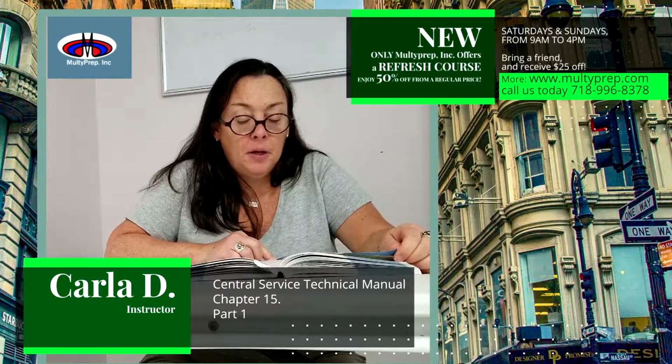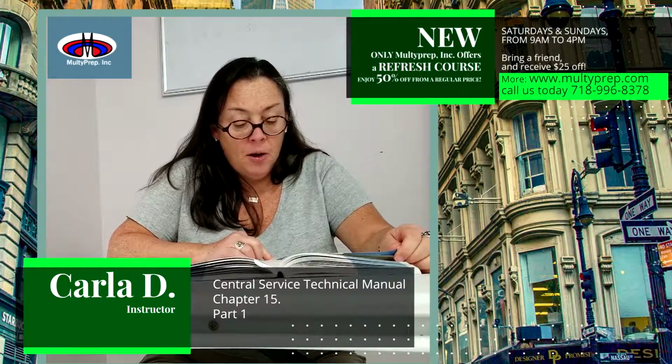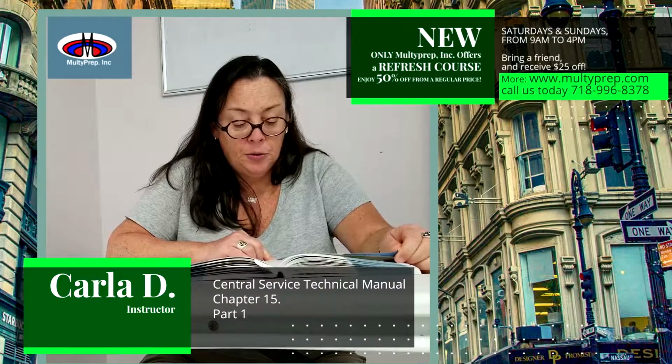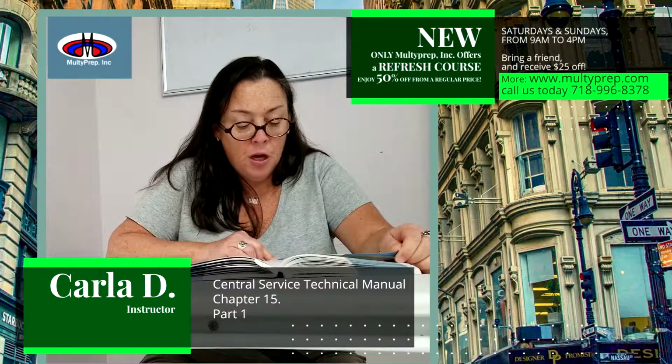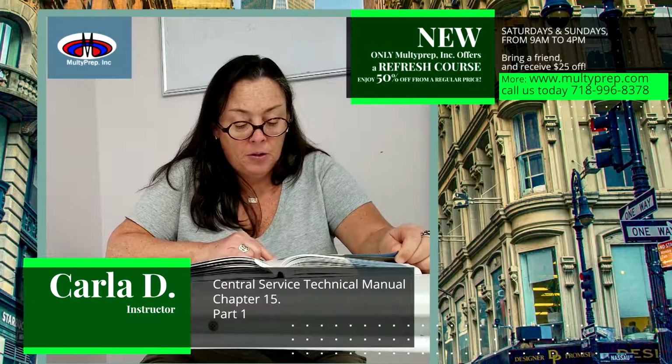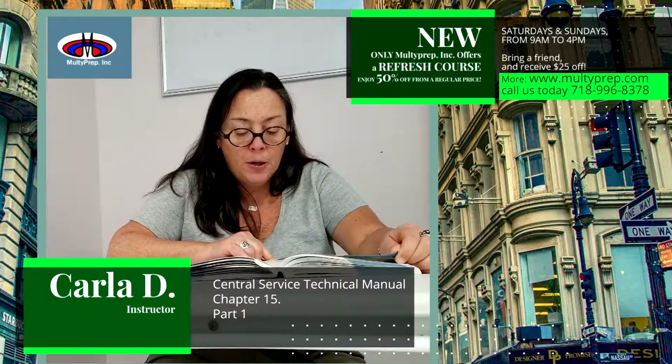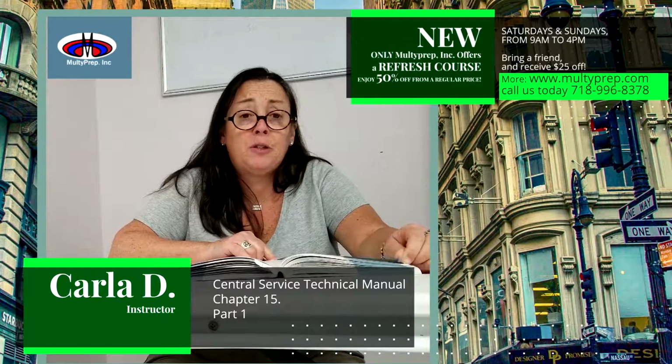Materials compatibility. ETO has an excellent compatibility with nearly all materials used in the construction of both single-use and reusable medical devices. However, as with all sterilization methods, it is imperative that CS technicians follow specific device manufacturer recommendations for the appropriate sterilization process for each specific item.